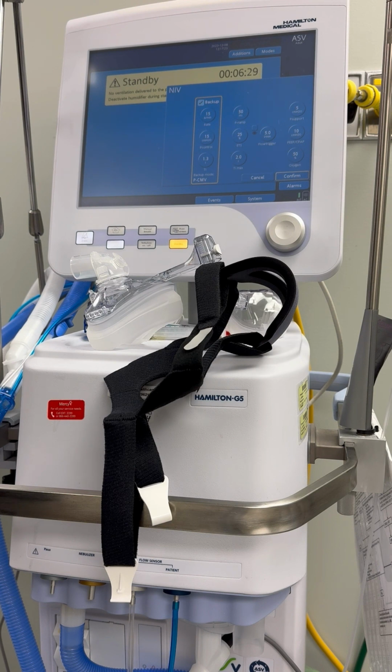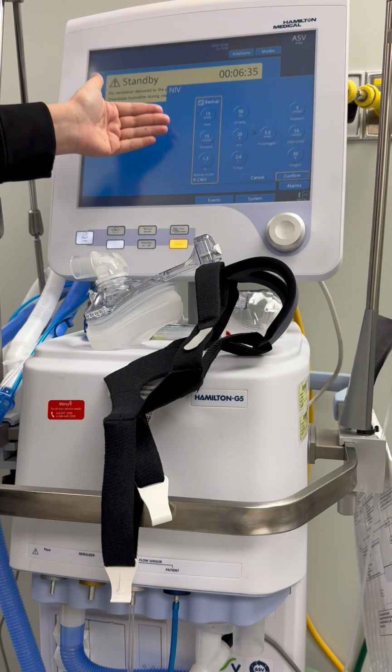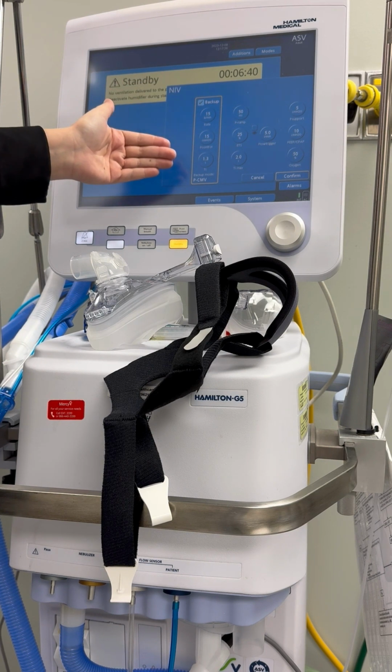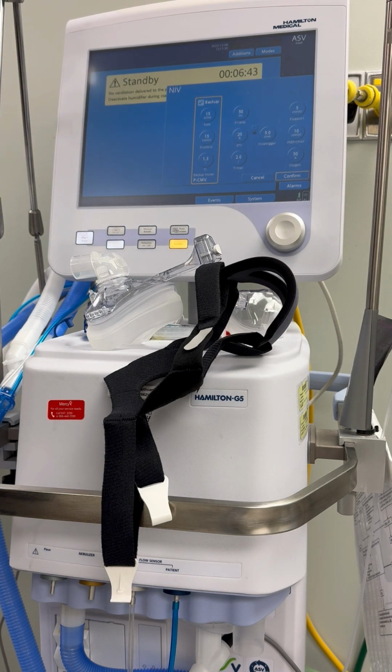So should your patient go apneic while receiving NIV therapy, they will go into this backup ventilation mode, which you can see here it's set for a rate of 15, a pressure control of 15, and an I time of 1.3. You can adjust that accordingly. So if the patient is in this mode, that patient's going to receive 5 of pressure support, 10 of CPAP, and 50% FiO2. Should they go apneic, they will be placed in the backup mode, which is pressure control. And once the patient begins to initiate breaths, the backup mode of ventilation will cease and it will revert back to NIV mode. So here you have a backup ventilation mode.